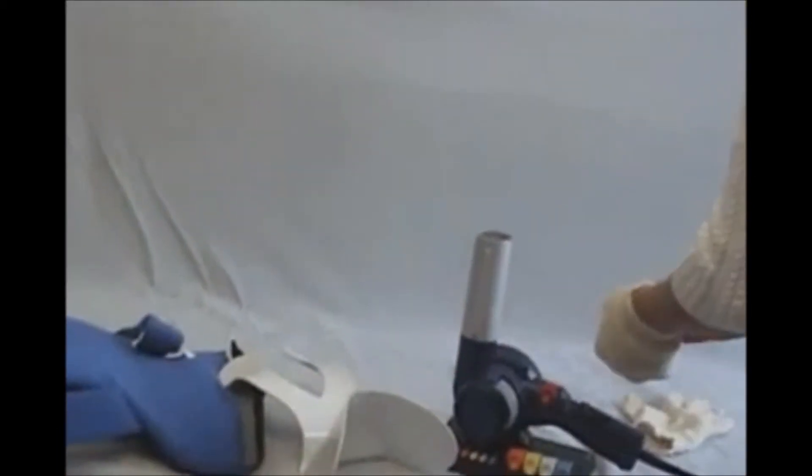that will change the degree. Now, when it's totally cool, I'm going to take my gloves off because they can stick to the velcro.